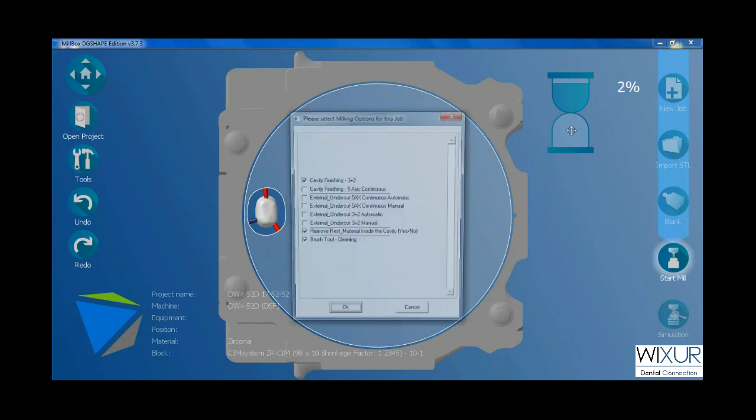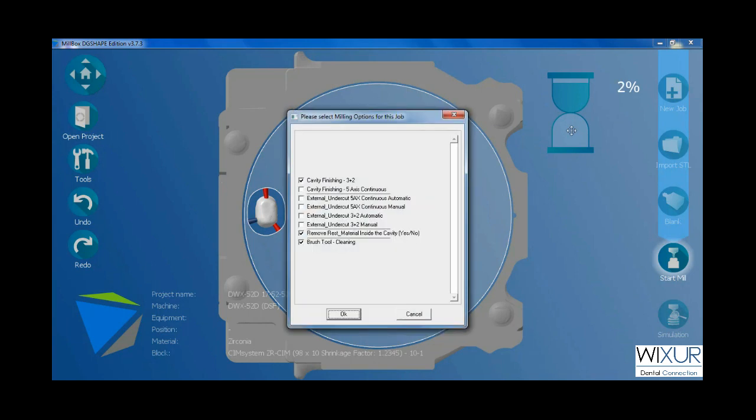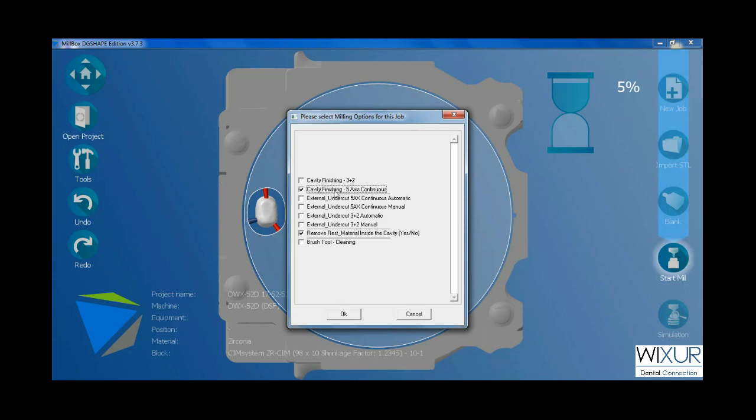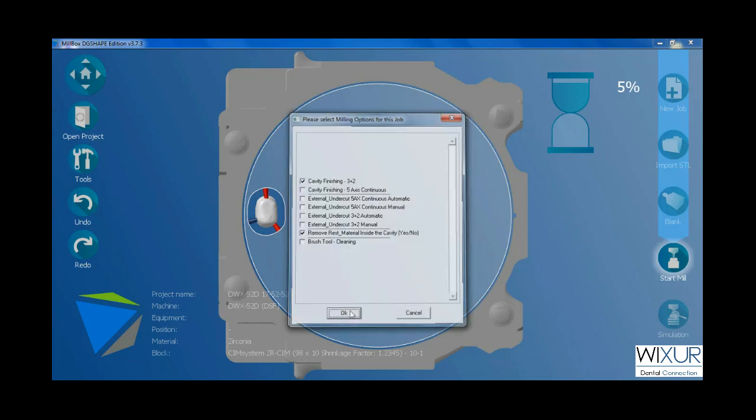After a while this window will come up. Deselect last box if you do not use brush tool in milling machine, as I do. And choose the strategy of milling based on axis. Click OK.